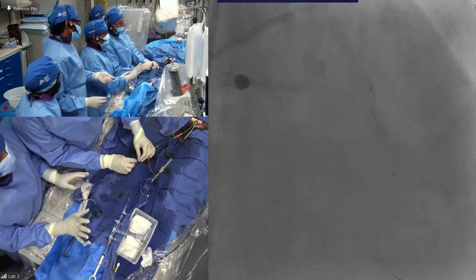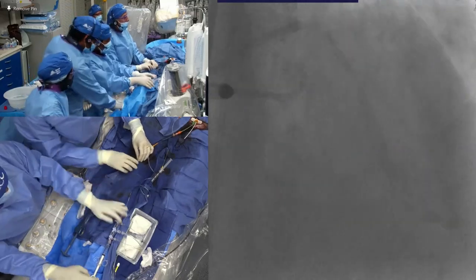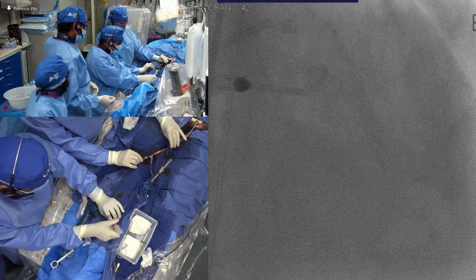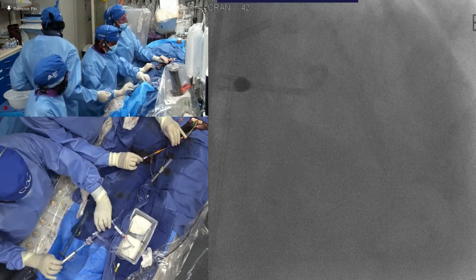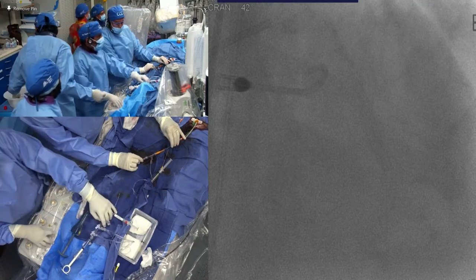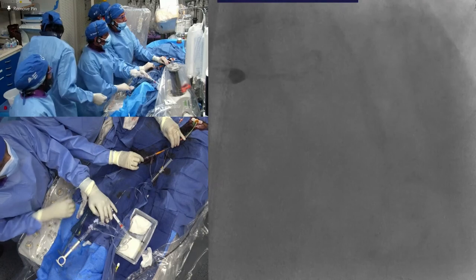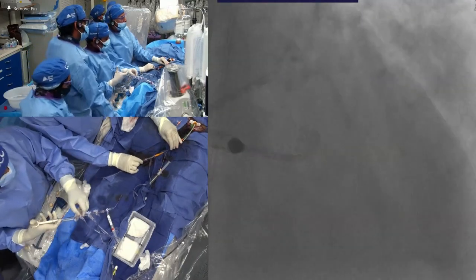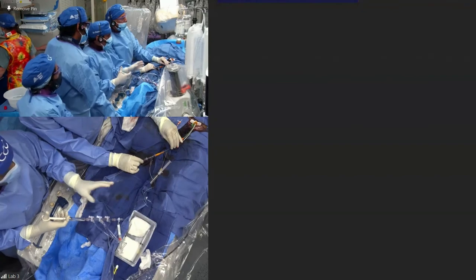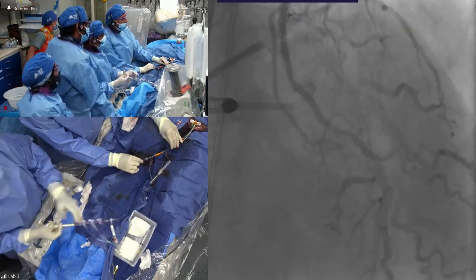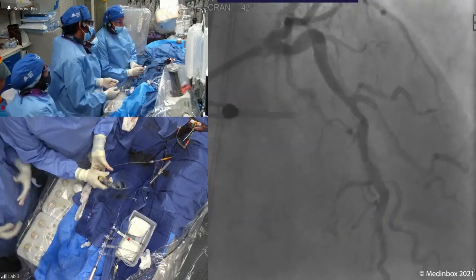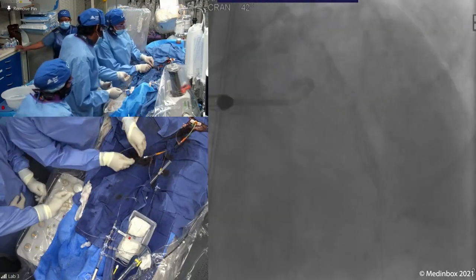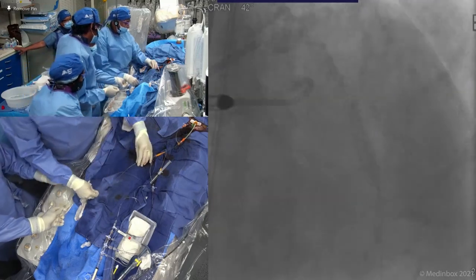Patient is tolerating. Clearly it all depends on how the patient behaves. So far the patient is behaving okay, but they can become restless. We have done the money shot already - beautiful, very nice. With that complexity, we are able to finish here. We'll go to the diagonal in a few minutes. The diagonal should be simpler - hopefully just do a rotational roto stent and you'll be done with that. Let's go to Dr. Kinney. Thank you.